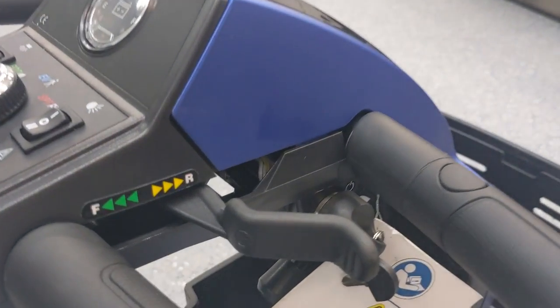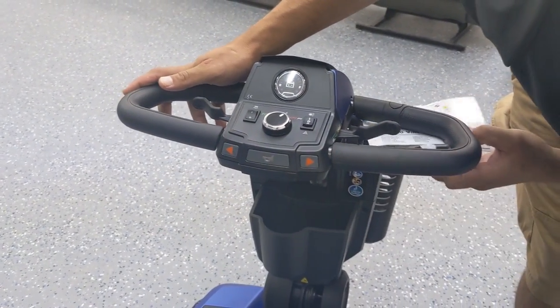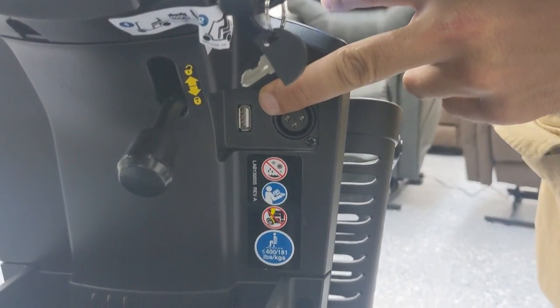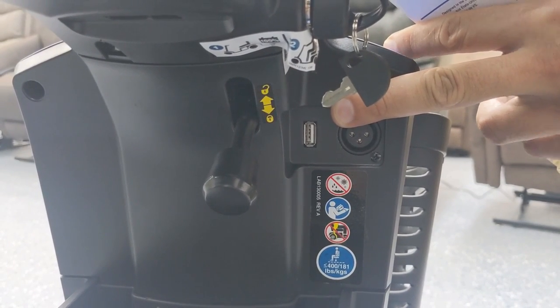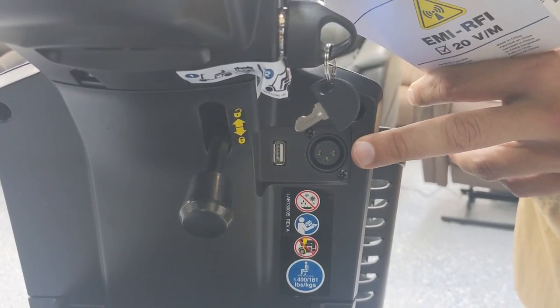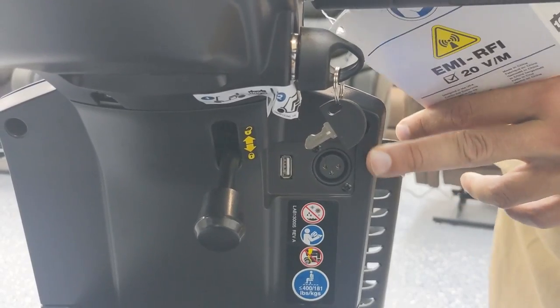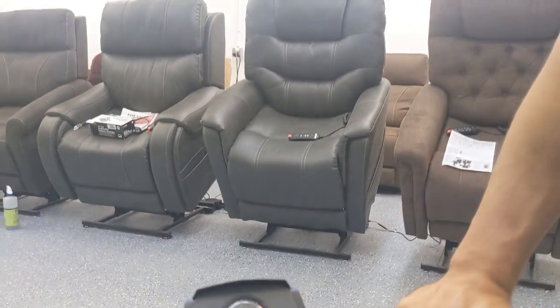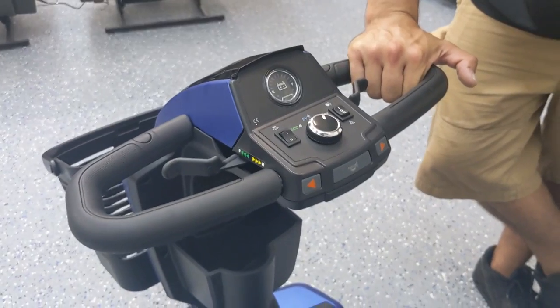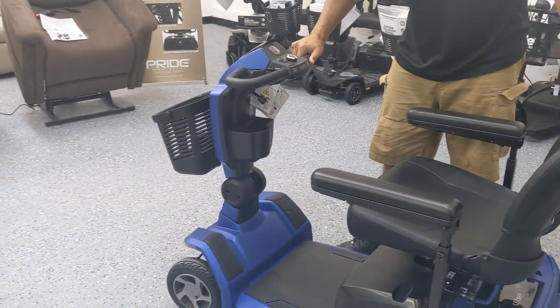The ignition is on the right-hand side with a key, which comes with two copies just like any other key. It also includes the charger and the user manual when purchased. The charging port is located right underneath the ignition, and there's also a very convenient USB port that will deliver a charge to a cell phone or any other device that uses a USB charging cable. To charge the scooter, you plug in the charger using an XLR-type connection. It takes about six to eight hours to charge — we usually recommend overnight if it's close to being dead in the red. It's a smart charger that will automatically turn off once it's fully charged.